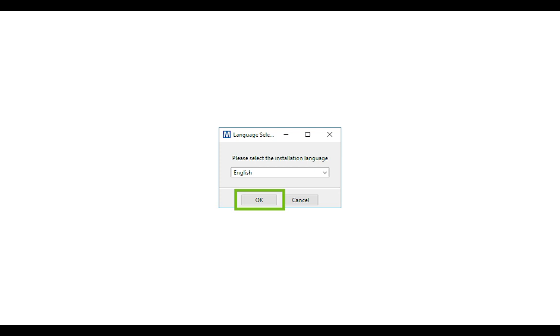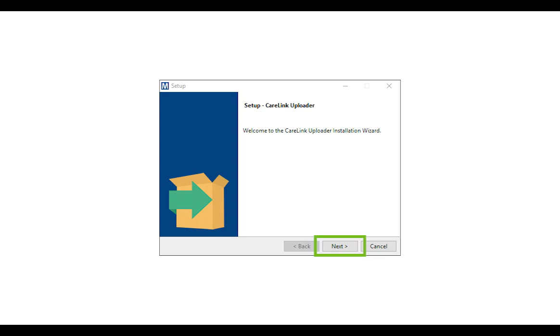On the first screen that pops up, select the language that is easiest for you to read. Select Next to begin the installation.